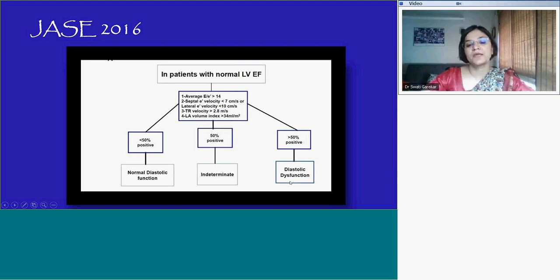If only one is positive, your diastolic function is normal. And in between, it is indeterminate. Simple.